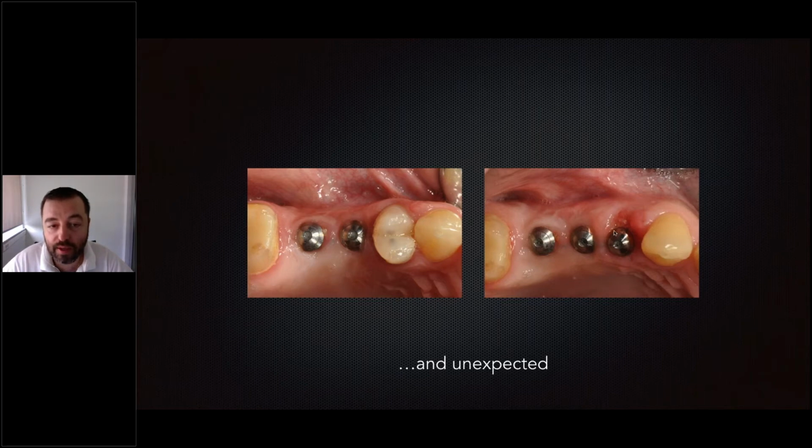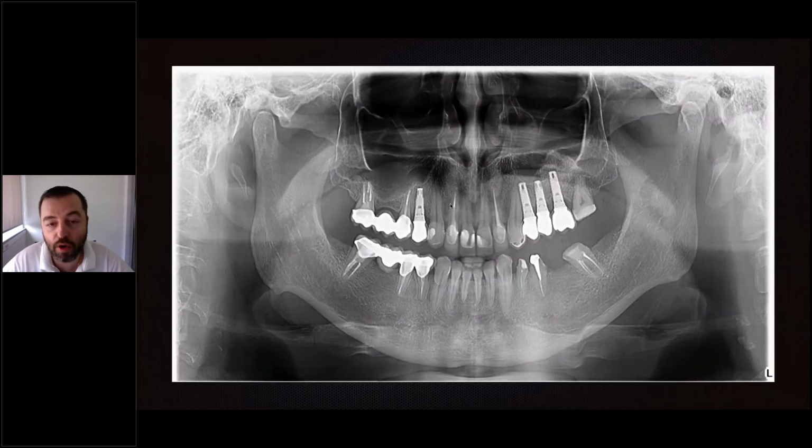And you see, this is a case where we did not, let's say, over-treat. Quadrant 1, we had 1 implant and 2 retreatments of the existing roots by our endodontist on microscope. Then we had an external sinus lift here, and for that implant, and for this one and this one, it was the one that fractured afterwards.